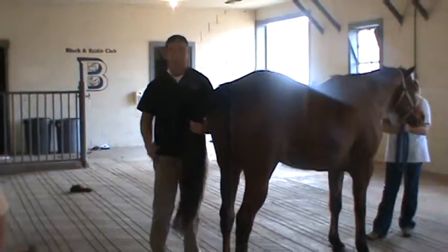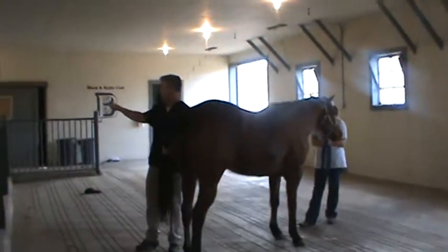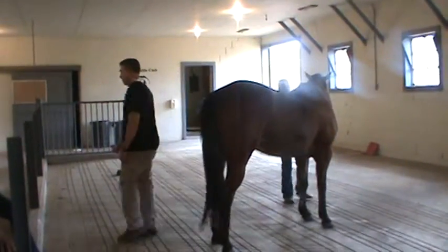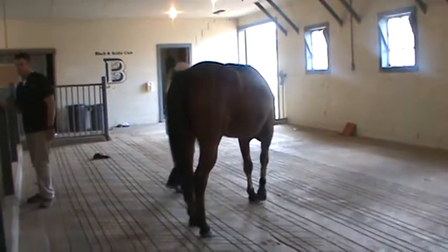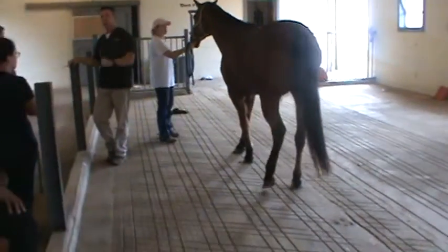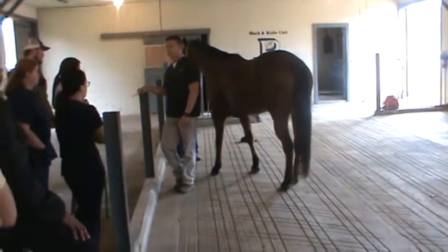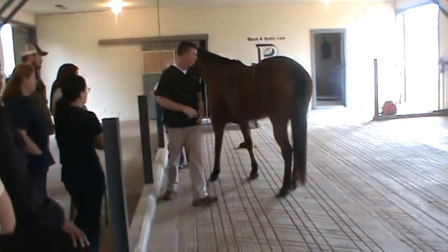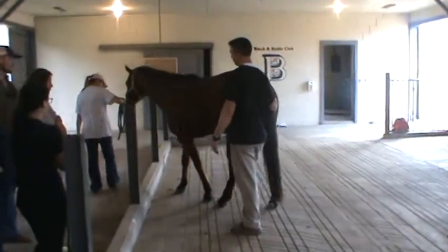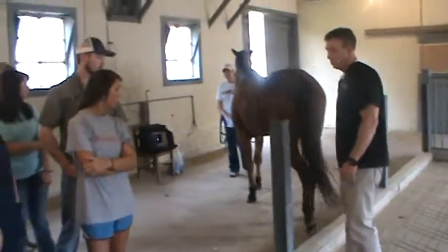Okay? All right. Why don't you put her head that way, and as close to that ultrasound as you can get it, and we'll see if she'll let us ultrasound. So, remember we talked about the ovaries in a horse are quite a bit further forward than they are in a cow. And we're going to try to visualize her ovaries.